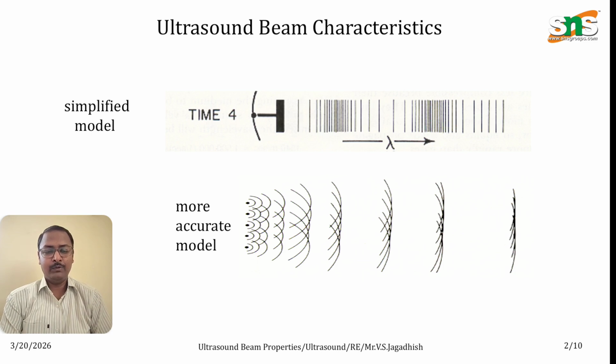If we have more than one piezoelectric crystal, as you see in the diagram with 4 or 5 together, each crystal is excited with the help of a voltage pulse, and during each vibration produced by the crystal, an ultrasound wave is transmitted. Each crystal oscillates and produces an ultrasound waveform.